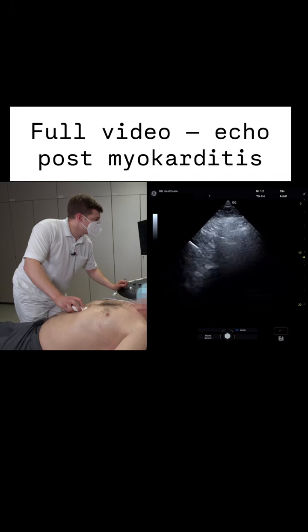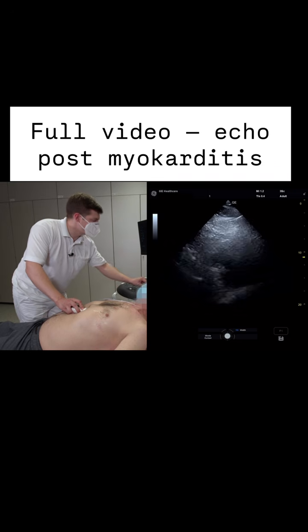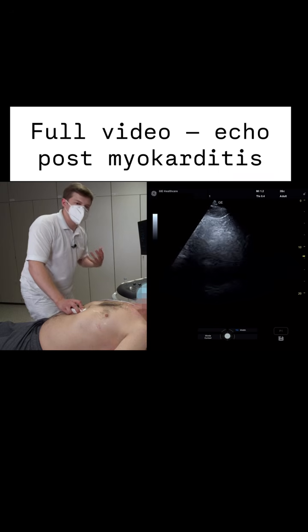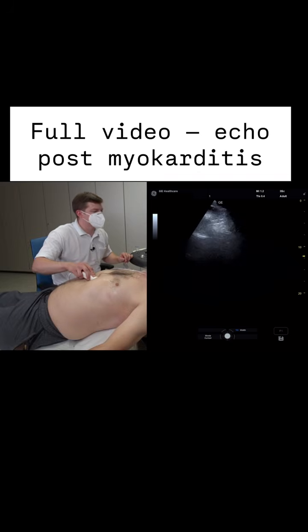It's very important that patients inhale into the abdomen, not into the thorax. And for him it's relatively hard because he had an ARDS, he's still dependent on oxygen, so it's not easy for him. Now there are some more tricks we can apply.